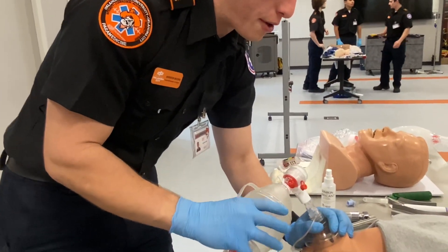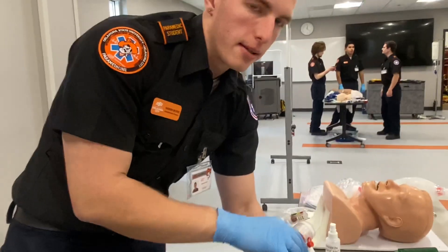So we're going to be watching, monitoring, hoping that they come back. Test complete.